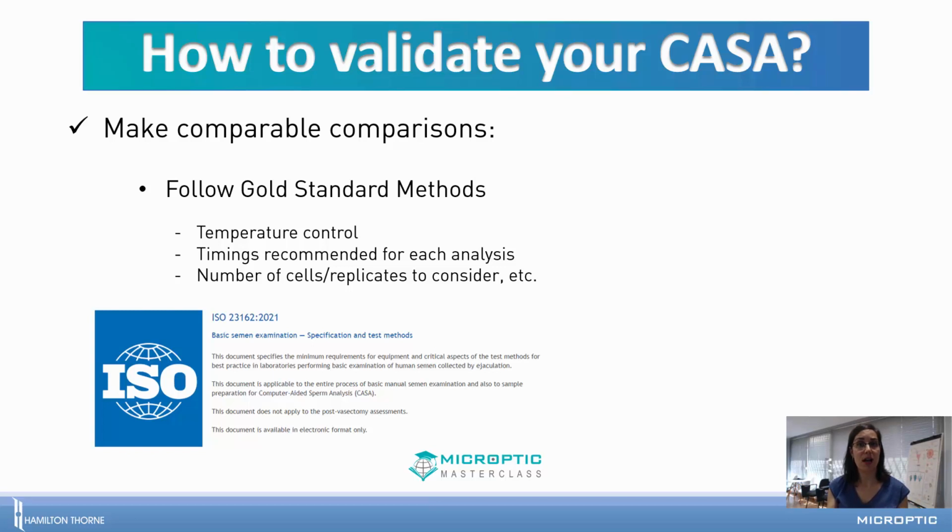So you need to analyze following the same criteria. This is why it's important to follow the gold standards like those provided by the ISO or by the WHO guidelines.